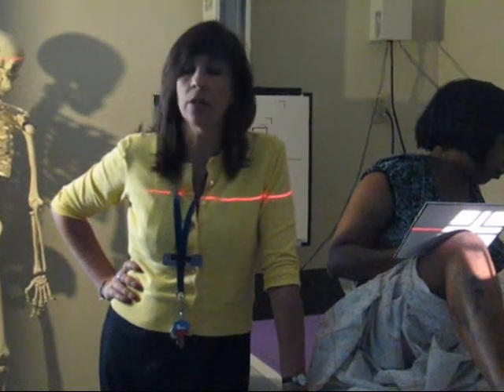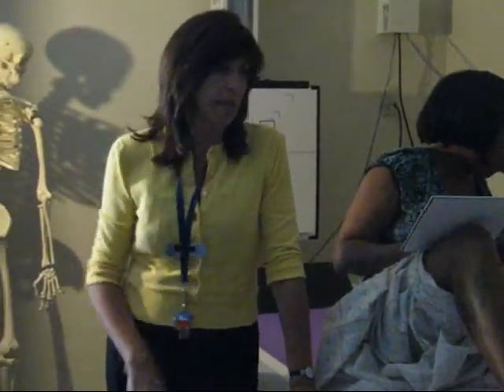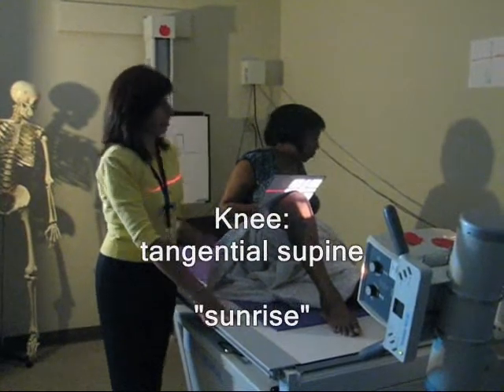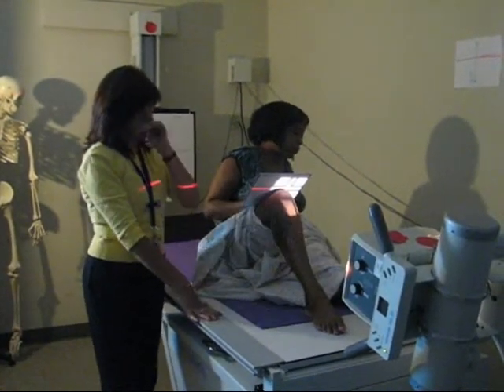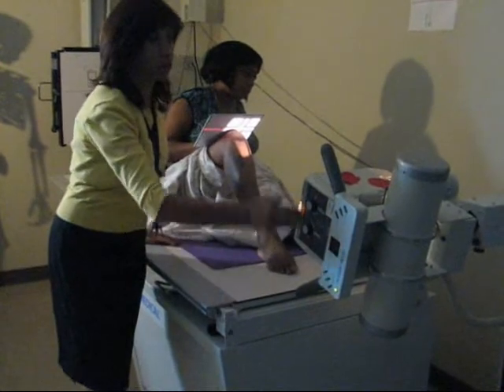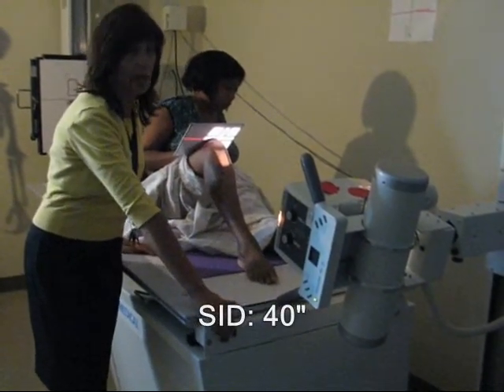In case your patient could not lay prone and bend their knee on the previous projection, this is an alternative method of doing a sunrise. The patient is sitting, which is a little more comfortable for some patients. You most likely have to bring your tube outside of the range of the table, because you have to lower it more than what the table usually allows.